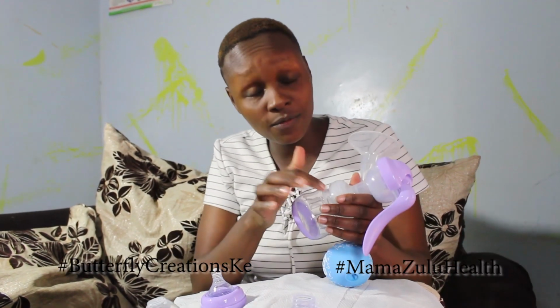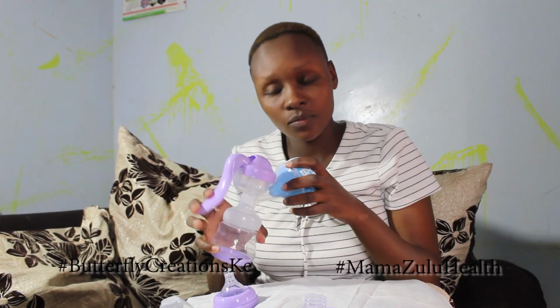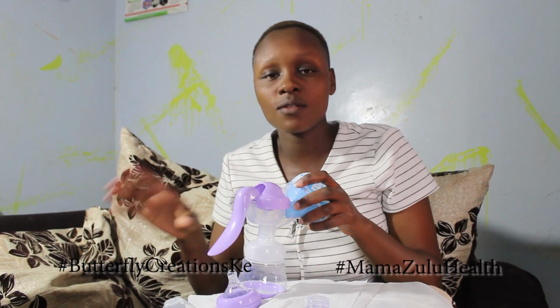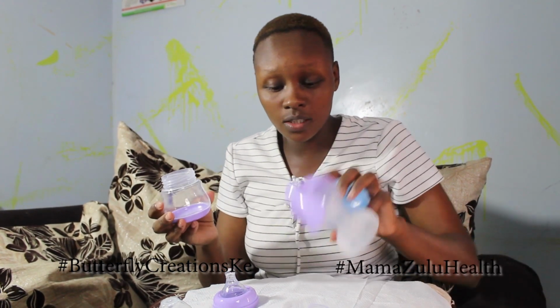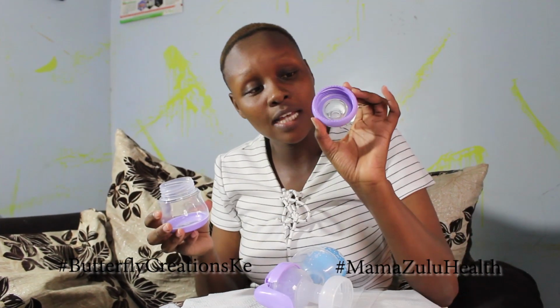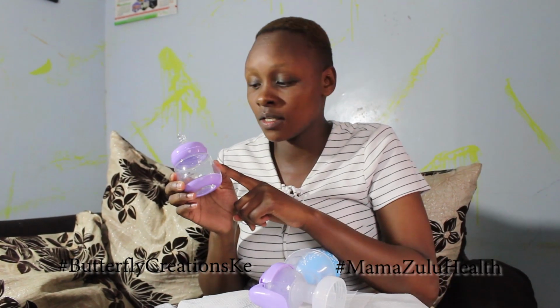So you transfer to your other feeding bottle, then you continue with this, because not all feeding bottles will fit here. You have to use the one that is specifically made for that pump. Then you continue again, and transfer until you feel comfortable and there's no more milk left. Once all your feeding bottles are filled up, you can use this. I told you I'd show you how to use this at the end. So you use this to close it, and you can use it to store the milk.